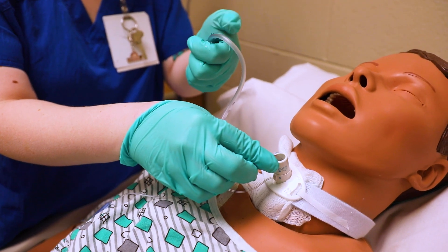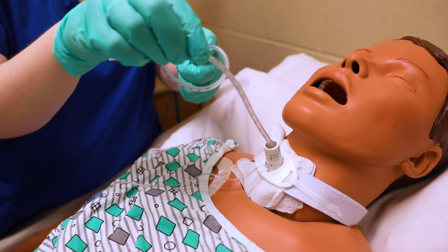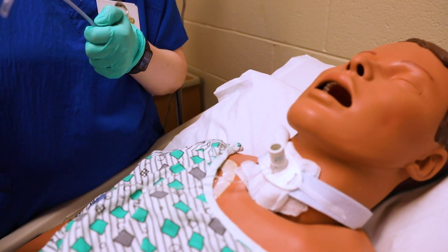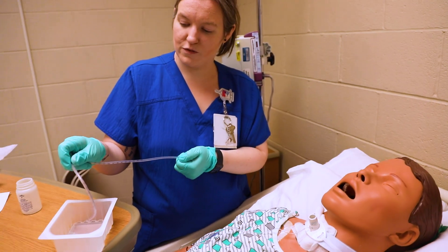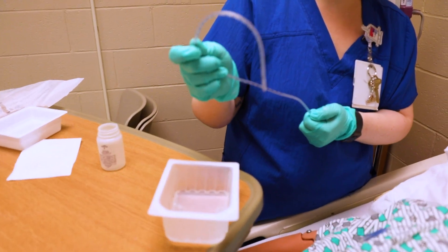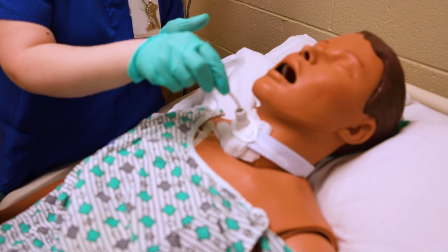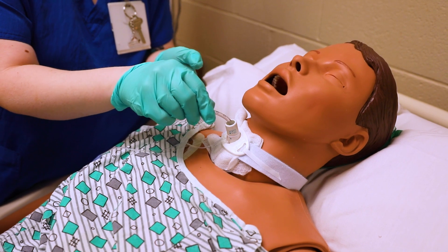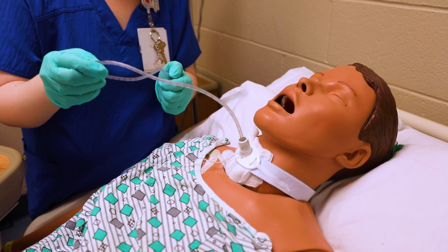There's a hole — you're going to pulse it. This is what I mean by pulsing: as you pull it out, do a little swirl. You can then dip this in your saline and suck up some of the water, which will help clear out your tubing. You can do another pass if needed — put your thumb completely away from the pulsing as you go in, then pulse as you pull it out. Never keep your thumb flat on it.